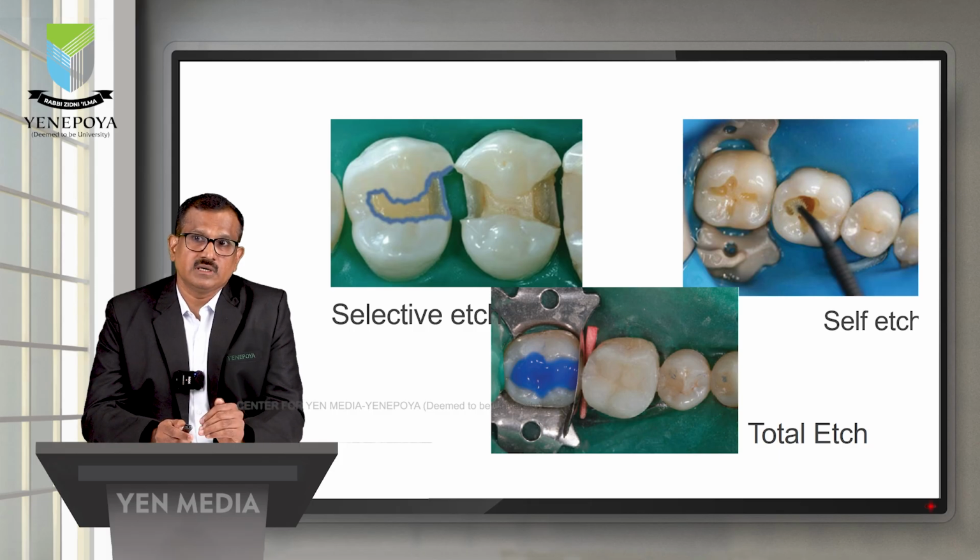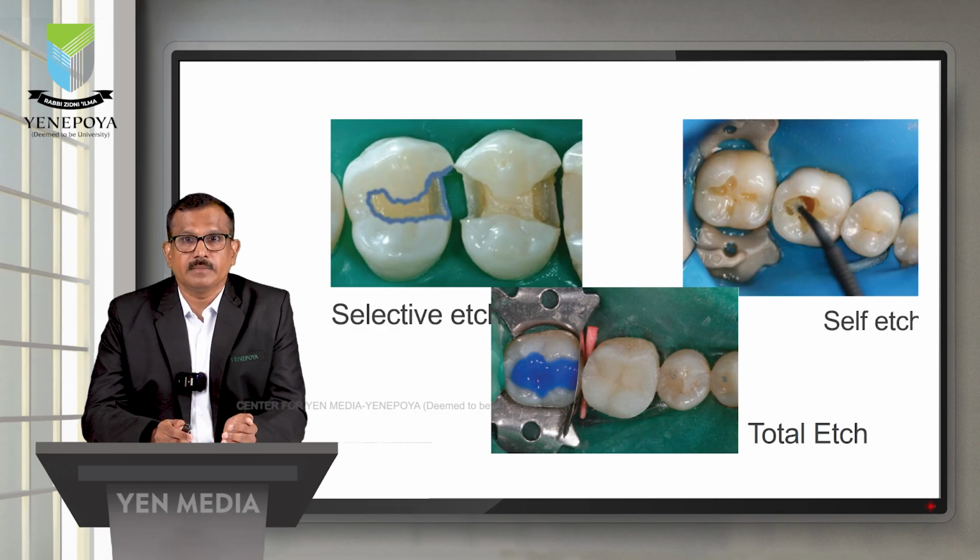Otherwise, even though they claim it to be self etch, it is better to etch enamel, because self etch or any etching incorporated adhesives will have only milder acids. It is said that it cannot penetrate much into enamel and needs more time, because the inorganic content is more. They are incorporated in such a way that they are more dentine friendly, because once dentine is over etched, there will be collapse of collagen and bonding might not take place well. So that is very, very important.